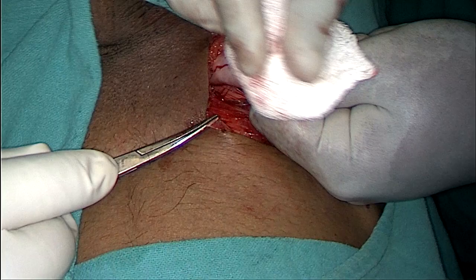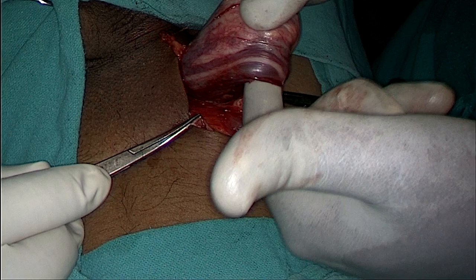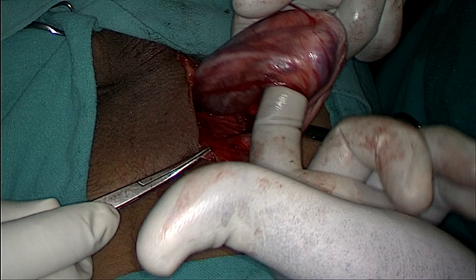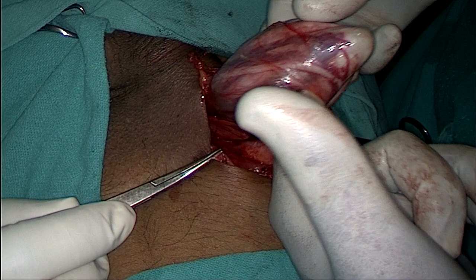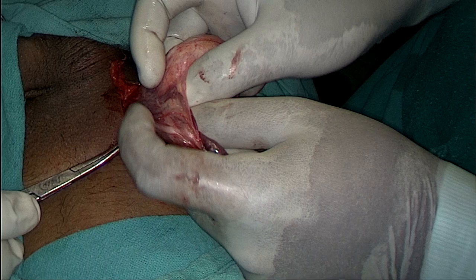The white structure you are seeing right now is the sac, which is adhered to the cord. You can appreciate there is a white thread on my left index finger — that is the cord. The blue ribbon you are seeing is the pampiniform plexus, which is attached to the sac. On my right-hand side is the sac that I am separating with the help of a mop. Now we are doing blunt dissection to remove this from the adhesions.